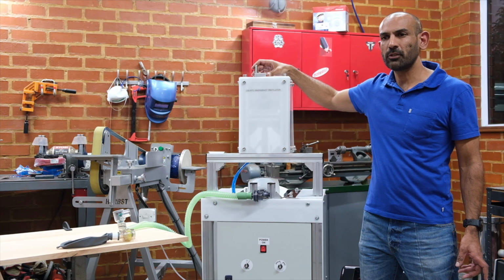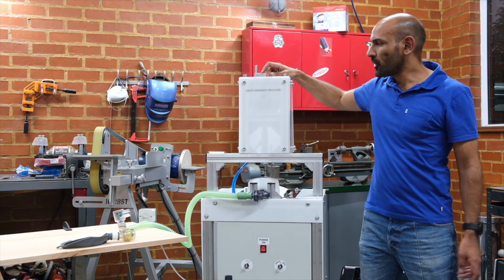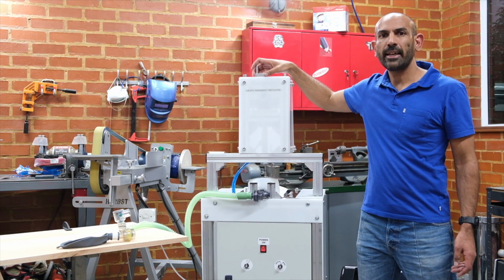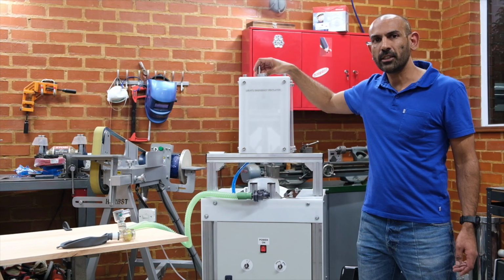Another change to this design, it was a problem that I had with the old design that I hadn't yet sorted out, was how do we control tidal volume. So I've incorporated this hand wheel, which controls the stroke of the cylinder. So you can either move it clockwise, and that will then increase the tidal volume, or you can move it anti-clockwise to decrease the volume.